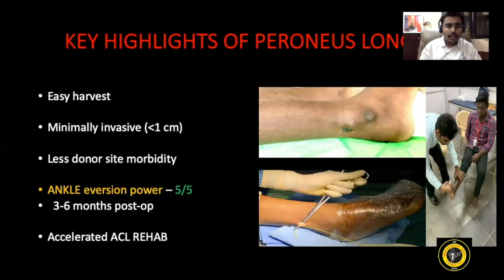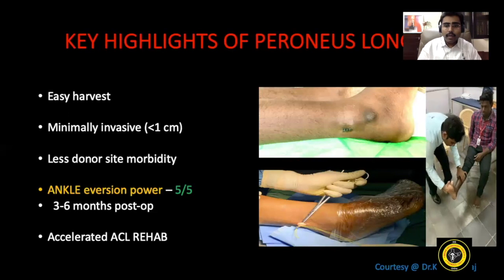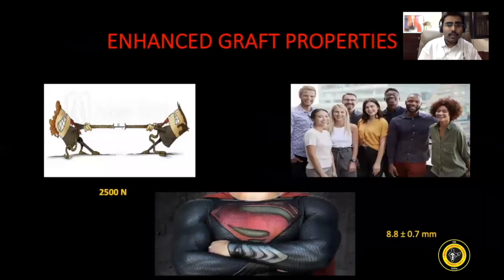The other important point is that with such a thick and bulky graft, I am more confident of an accelerated ACL rehab program. Now that is me testing the ankle power. Completely normal. Sorry for the sound.